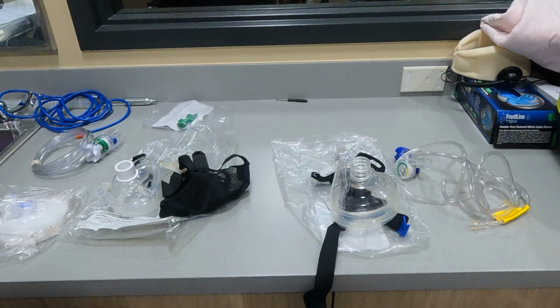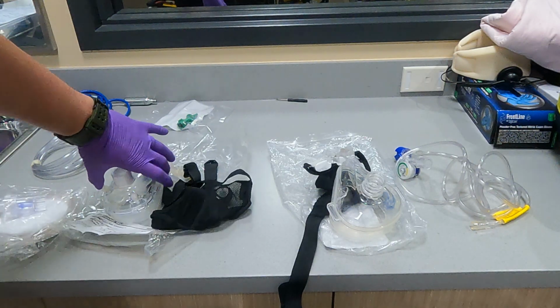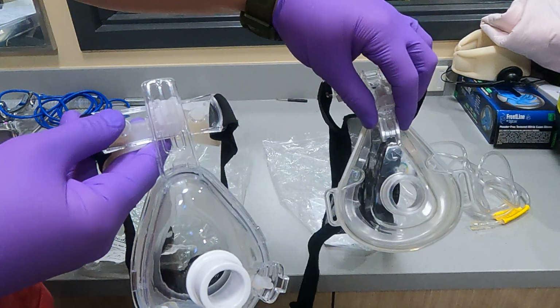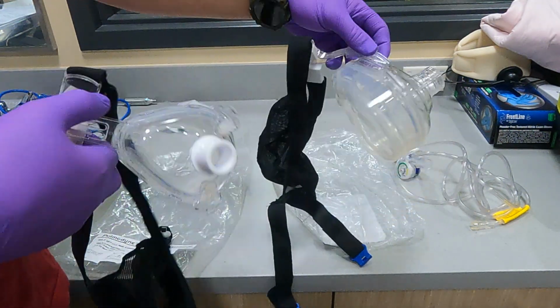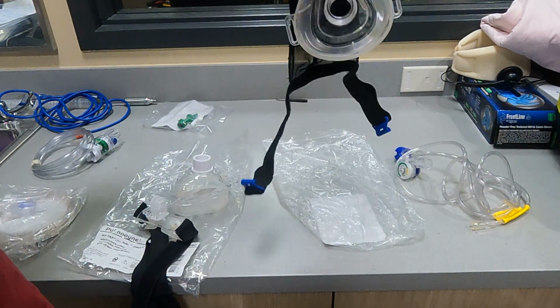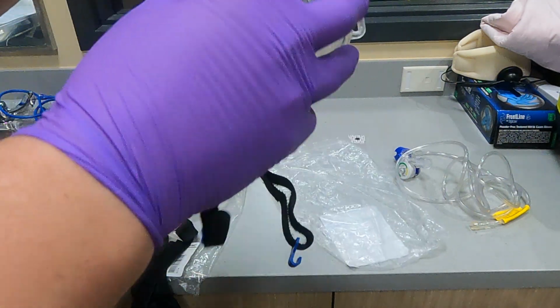So let's talk about setting up our CPAP, and then we will go into how to apply CPAP to our patient. So I have two different CPAPs here. I have an older style mask here, and then I have a newer style over here. You'll notice both of these have a face mask. Inside of both face masks, we have a double layer seal here. So this needs to form a tight seal around your patient's face. We can't have any air escaping from it, otherwise it's not going to work as intended. So it's got double layer seal.